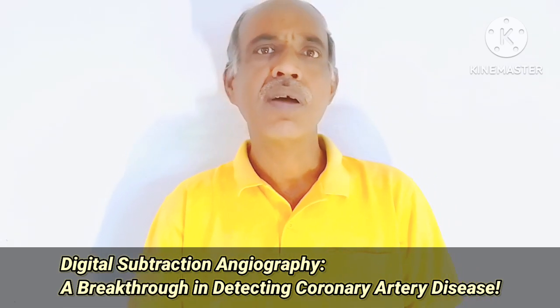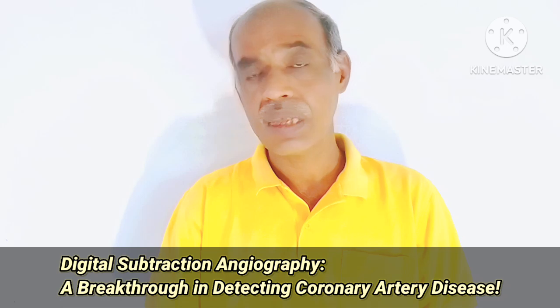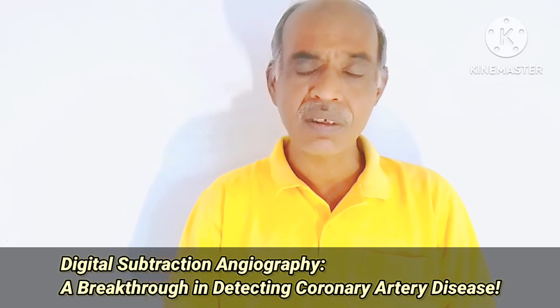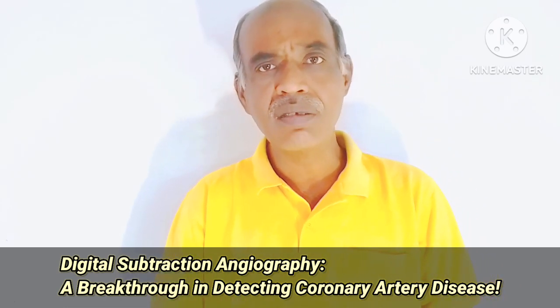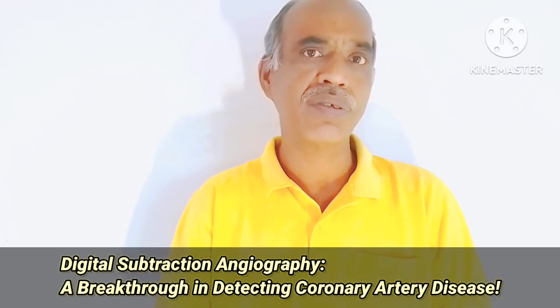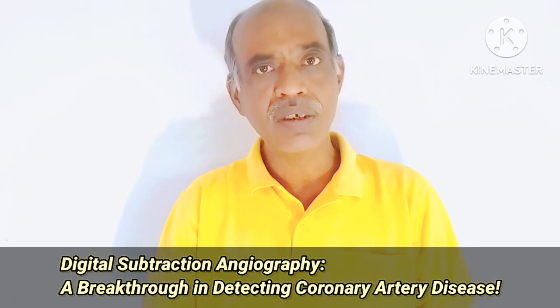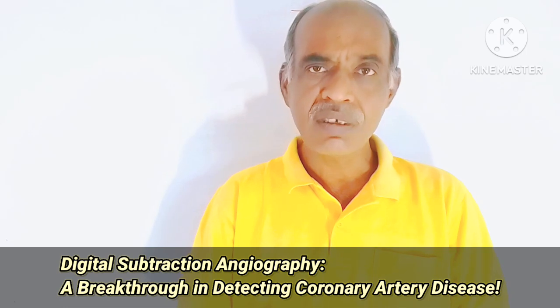Third step, again an X-ray is taken. That means here the X-ray is taken with contrast-enhanced blood vessels, because you have already injected a contrast dye into the blood vessels. So this is the second image.